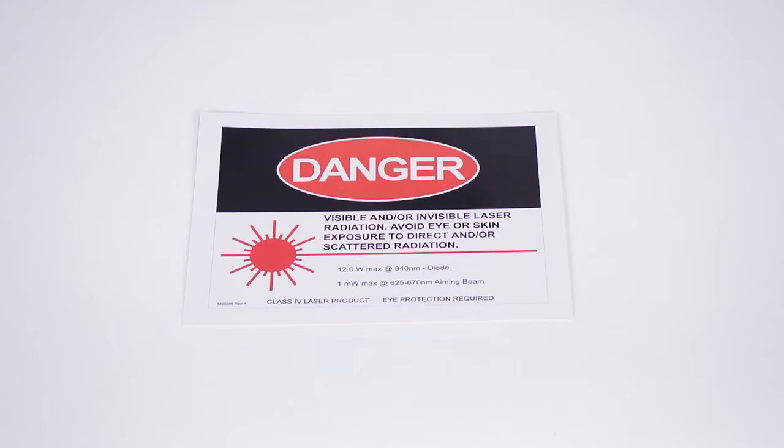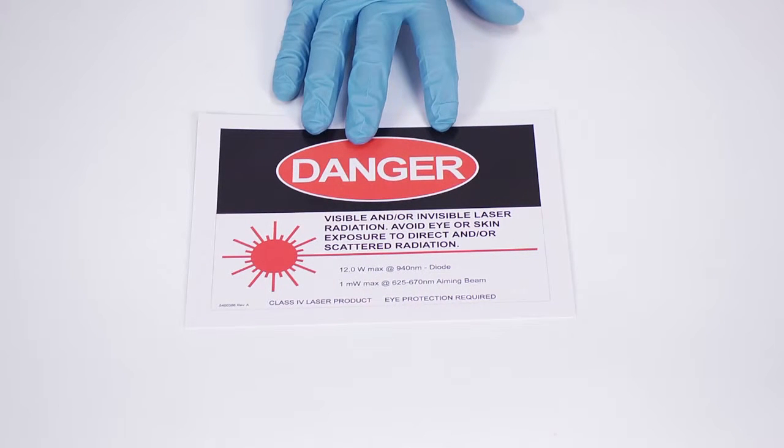Finally, the laser danger sign for your clinical workspace where the EPIC laser will be used is tucked inside the foam attached to the top lid. Be sure to remove and place in plain view in the work area where EPIC will be used.